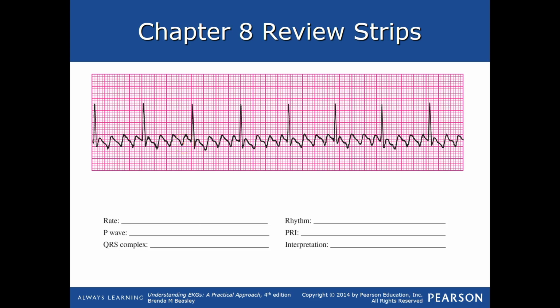Now in the future, if you have a written test and you're asked what is this rhythm and you say atrial flutter, I will not require you to say a 4-to-1 ratio.